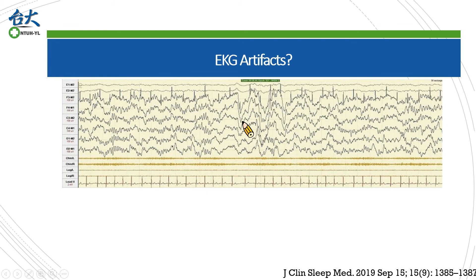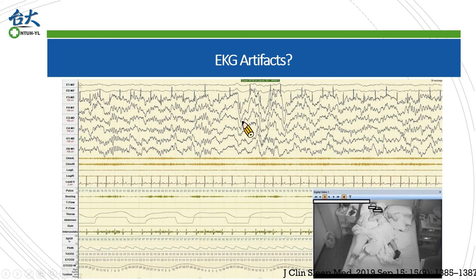Another interesting artifact is demonstrated in this case. In the third phase there is one EKG artifact; however, when we see the last trace shown as EKG, the frequency is not similar. What happened? Actually this is a child polysomnography. Occasionally the parent should sleep together with the child during the exam, and the EKG comes from different subjects in the study.